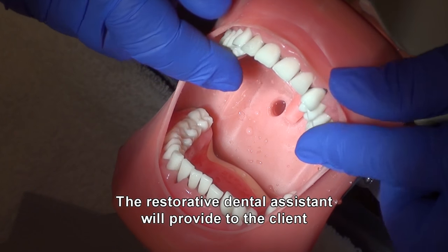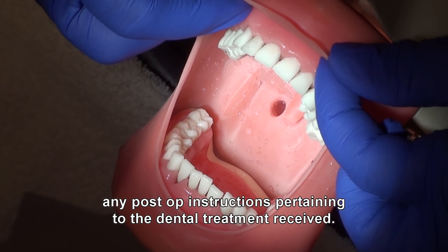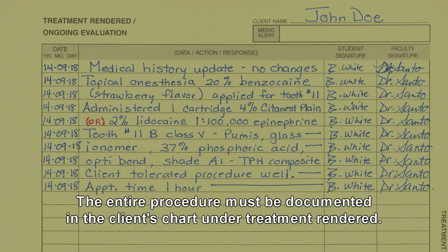The restorative dental assistant will provide to the client any post-op instructions pertaining to the dental treatment received. The entire procedure must be documented in the client's chart under Treatment Rendered.